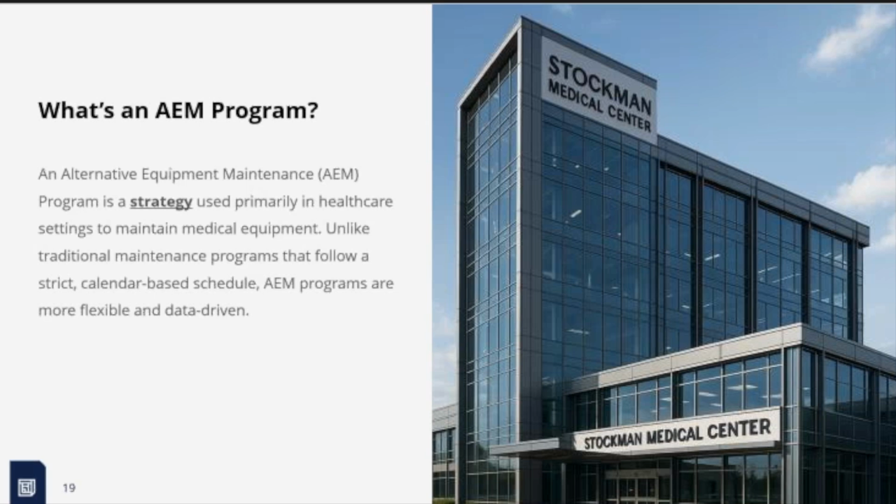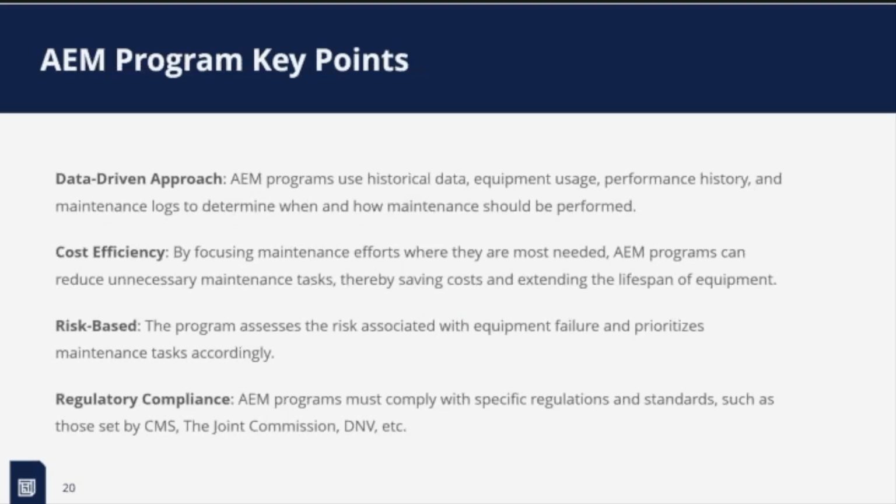So the AEM program itself is a strategy used primarily in healthcare. That's where we're doing this, to maintain medical equipment. Unlike traditional maintenance programs that follow a strict calendar-based schedule, AEM programs are more flexible and data-driven. So we'll look at some examples of how we got to some of the changes in building an AEM program. So again, it's a data-driven approach.